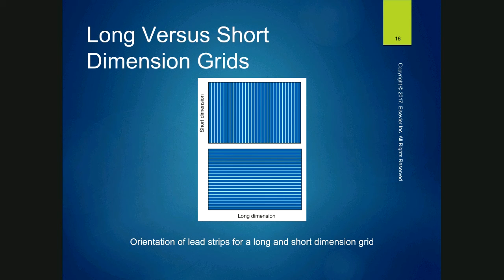Why does this matter? This matters because whenever you go do a portable exam and you have one of those patients who is extremely kyphotic, so they're super hunched over, and you are trying to line up to their sternum, because that's what you're supposed to do for an AP stretcher chest, right?